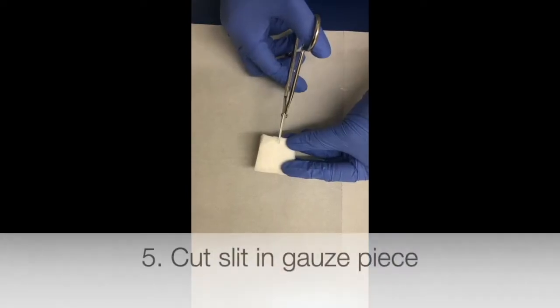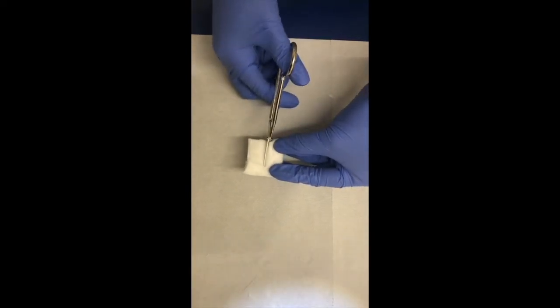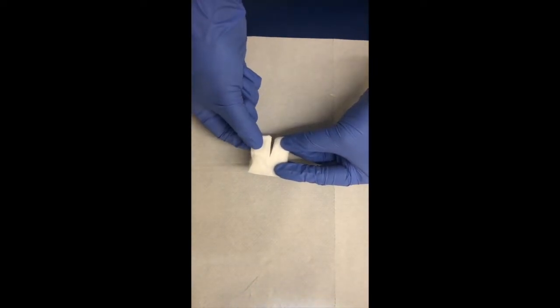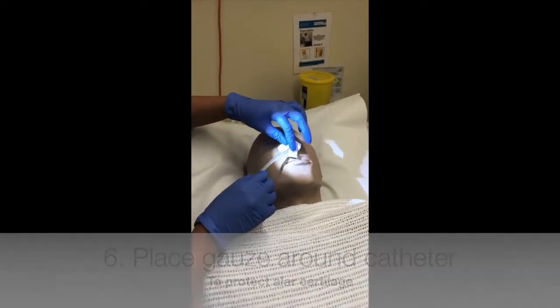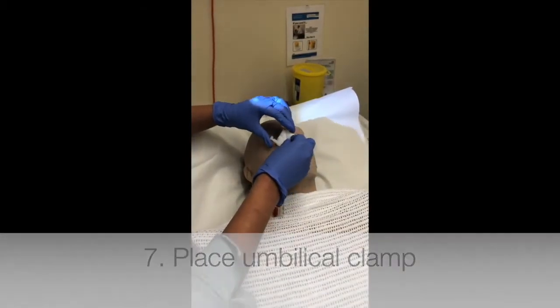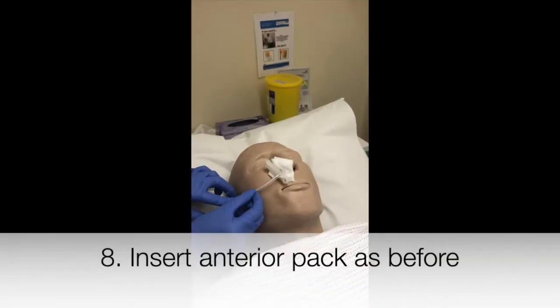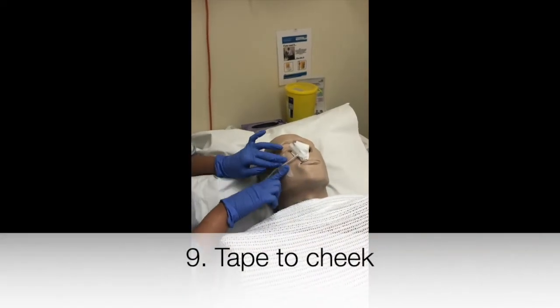Cut a slit into a gauze piece and place the gauze around the catheter to protect the alar cartilage and prevent alar necrosis. Place an umbilical clamp onto the catheter. Insert an anterior pack as shown in the video previously, then tape the catheter to the cheek.